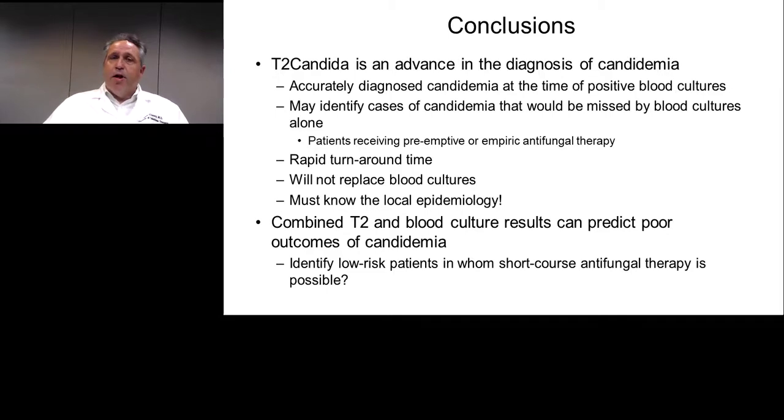However, we know that they will be used best in conjunction with blood cultures rather than as a replacement for blood cultures. And it's imperative that you understand your local epidemiology. If you're at a center that sees a large number of Candida species other than the big 5, then test performance may differ than at centers that are seeing almost exclusively the big 5 Candida species.